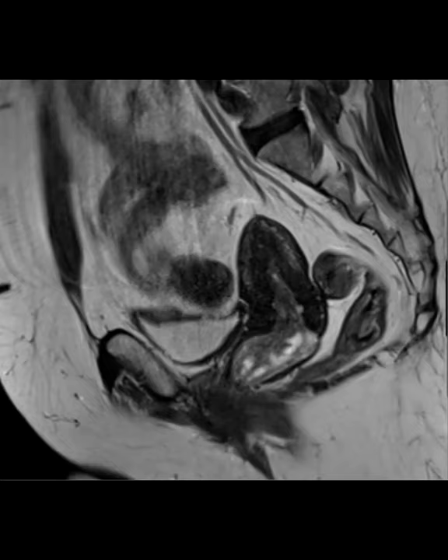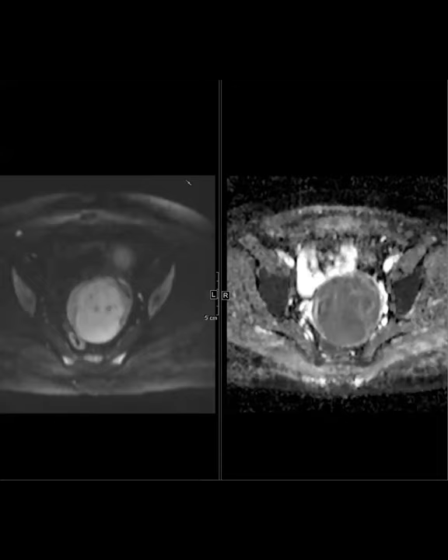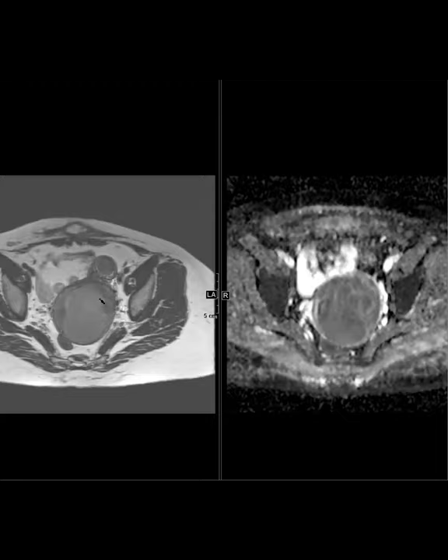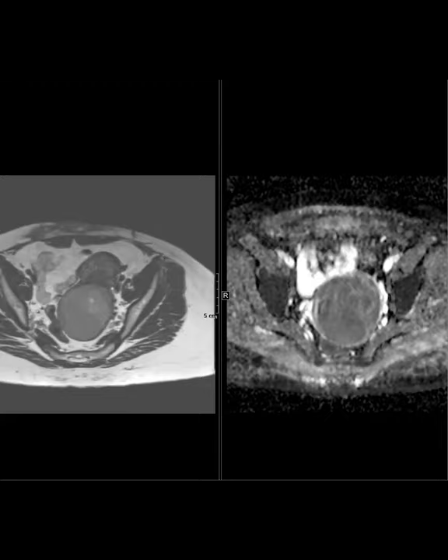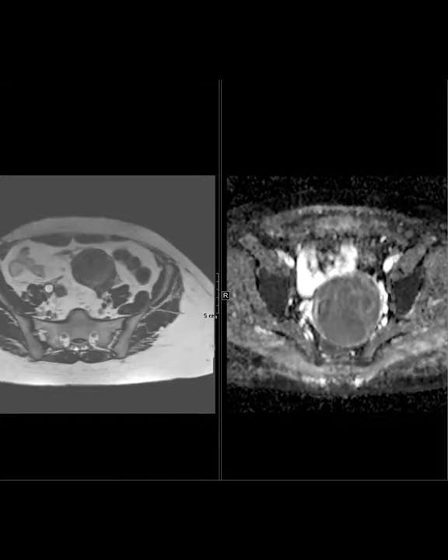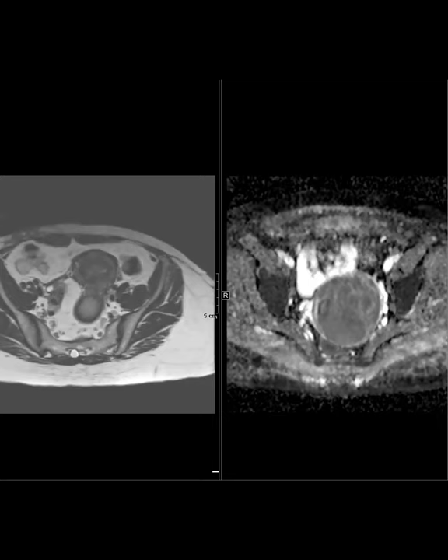We kind of hedged and basically said, while this could be a fibroid because it has relatively avid enhancement, we didn't think it was definitely a fibroid because it wasn't definitely T2 dark, super T2 dark. So we recommended it. We said it could be either a fibroid or a cancer. We didn't bring up leiomyosarcoma, so it was kind of a surprise to us. It doesn't really look like it's uterine. So I think it was truly a cervical leiomyosarcoma, but it just wasn't on our radar, but just something to think about.